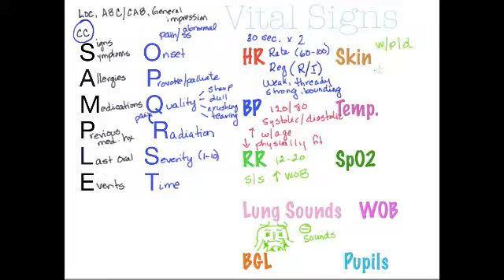However, if we find our patient is pale or cool or moist, and these are my abbreviations here, that is a finding of shock. All right, so we're going to assess their skin as well. Temperature is part of assessing the skin, but we're going to do that with a thermometer, and that's considered a vital sign now.